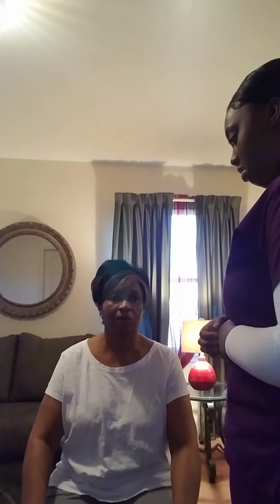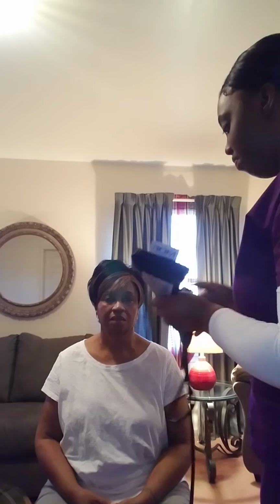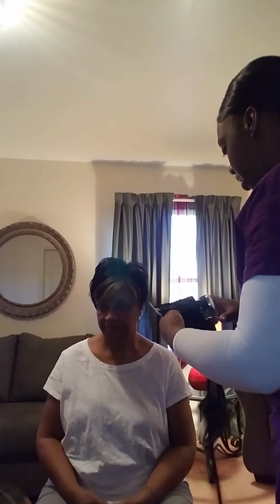All right. Do you have a special mattress at home? No. Okay. Do you use any oxygen? No. All right. And I do not see any IV lines, any sort of ostomies or dressings. Is that correct? That's correct. All right. Perfect. So now I'm just going to start off with your vital signs. All right. So I'm going to grab my stethoscope. Can you stretch your arm out for me? Thank you.